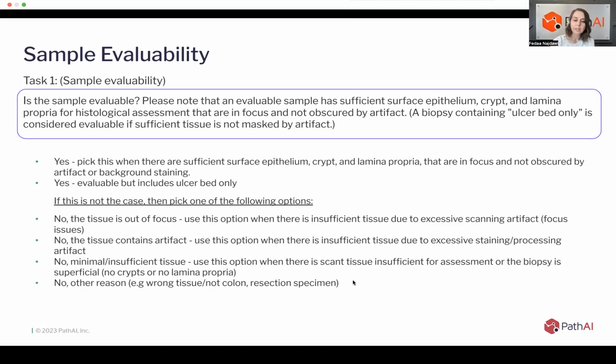In that case, we'll give you a free text field to enter what you think is the reason for the sample being unevaluable.